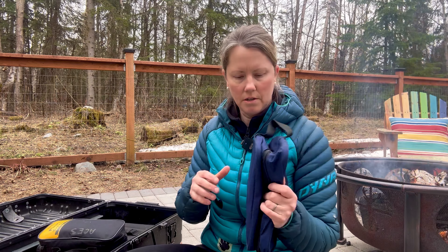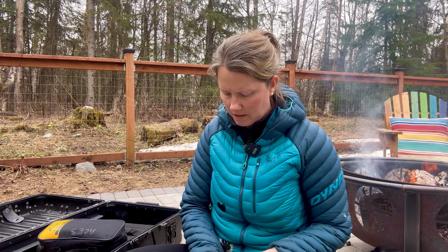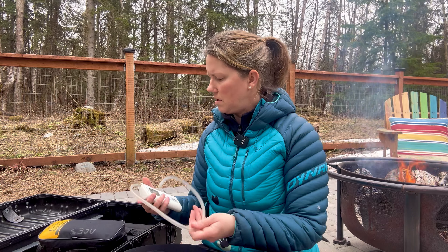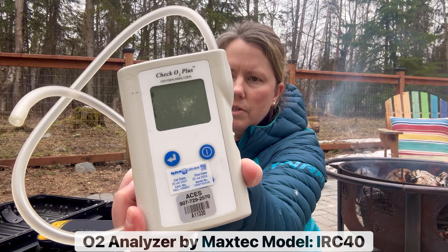This is a bit of a big bag for it — I think I'm going to look for a smaller one — but this is my O2 analyzer that I use on oxygen concentrators.